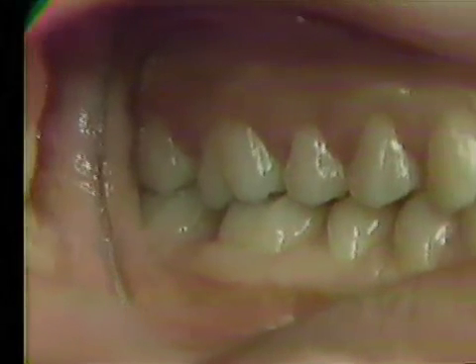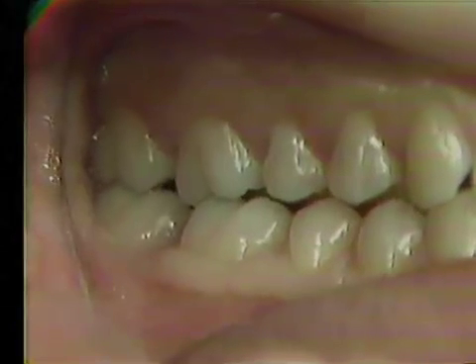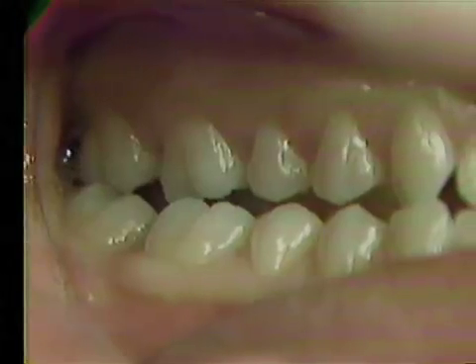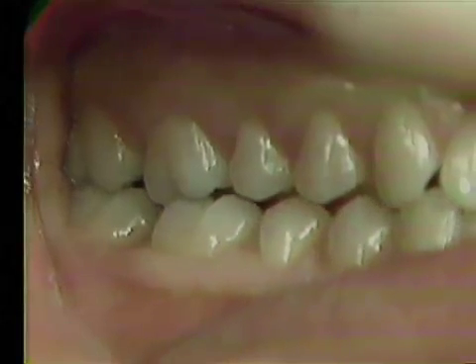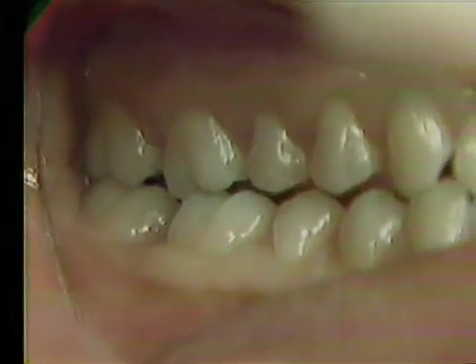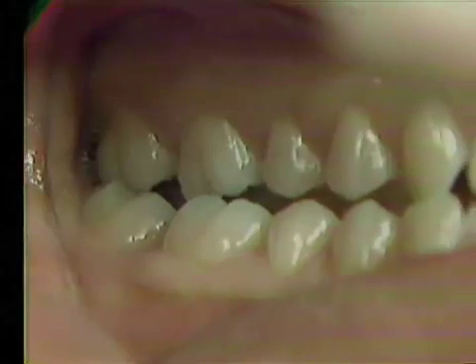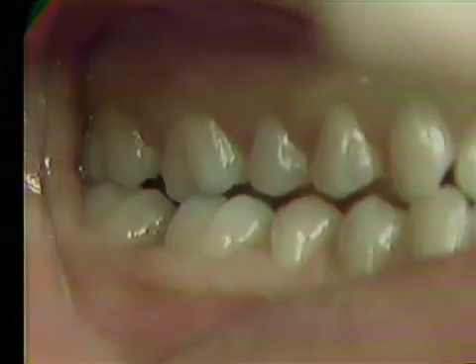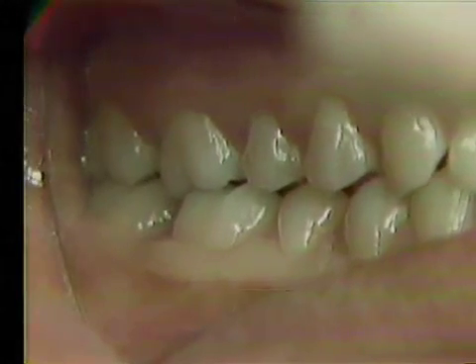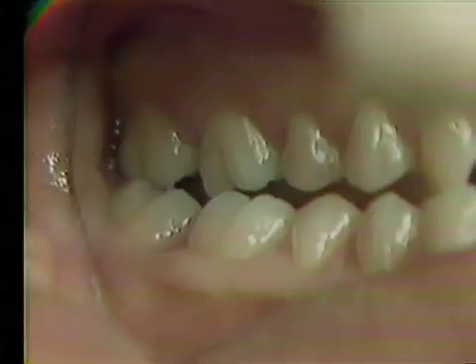The posterior teeth on the left working side are examined in the mirror. The first molars are contacting simultaneously with the cuspids. The rest of the teeth disocclude. Contact or lack of contact can be verified with shimstock, articulating paper, or occlusal indicator wax. Examine the mandibular movement for unevenness caused by posterior contacts. Some posterior working contacts can interfere with smooth lateral excursions, cause tooth mobility, or prevent anterior teeth from occluding. Under such conditions, these contacts would be interferences and require adjusting. Not all posterior working side contacts are interferences, but a single bicuspid or molar contact without simultaneous occlusion on the cuspid is not desirable. Acceptable types of working guidance are cuspids only, group function (cuspids and all the posterior teeth), or partial group function (cuspids and several of the posterior teeth).